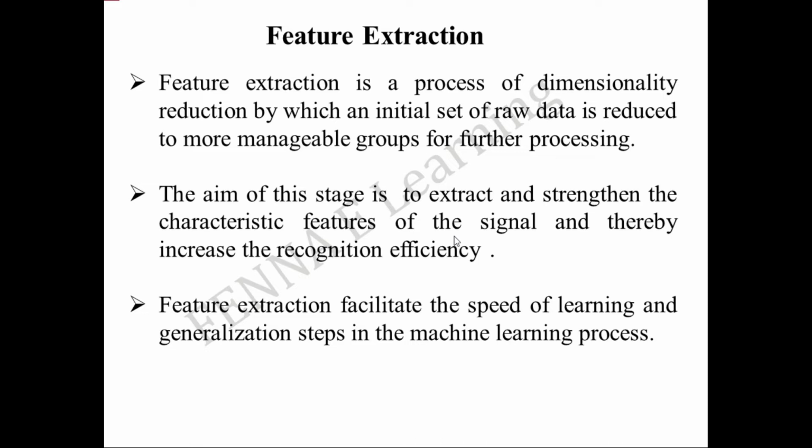The next step is feature extraction. Feature extraction is a process of dimensionality reduction by which the initial set of raw data is reduced to more manageable groups for further processing. The aim of this stage is to extract and strengthen the characteristic features of the signals and thereby increase the recognition efficiency. Feature extraction facilitates the speed of learning and generalization steps in the machine learning process.